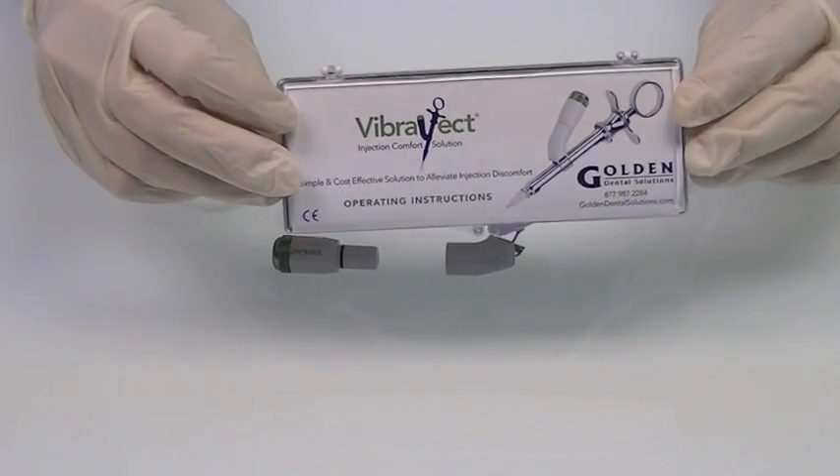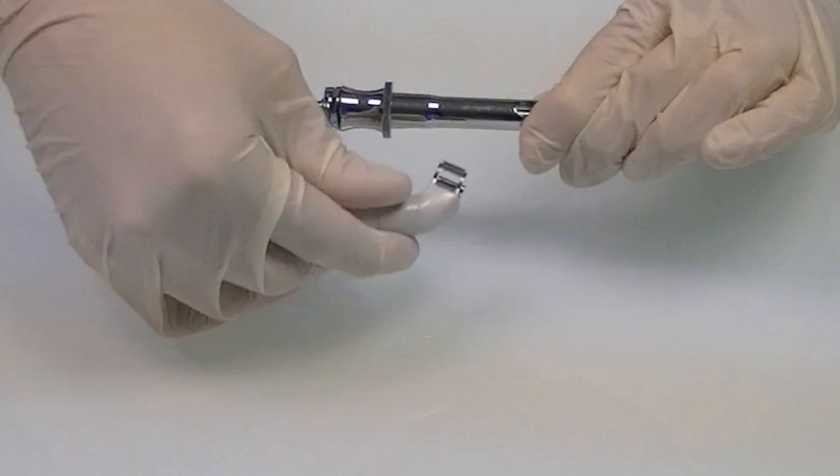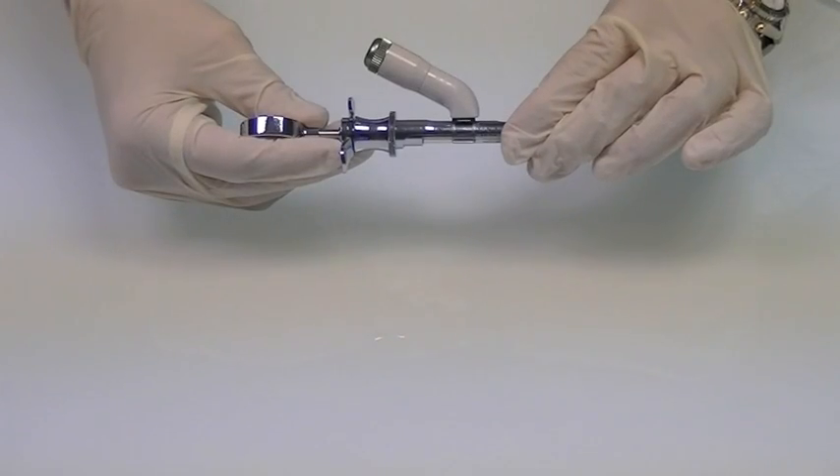The Vibroject is a cost-effective device that snaps right on to your existing syringe. There are no new procedures to learn and no disposable aspects.